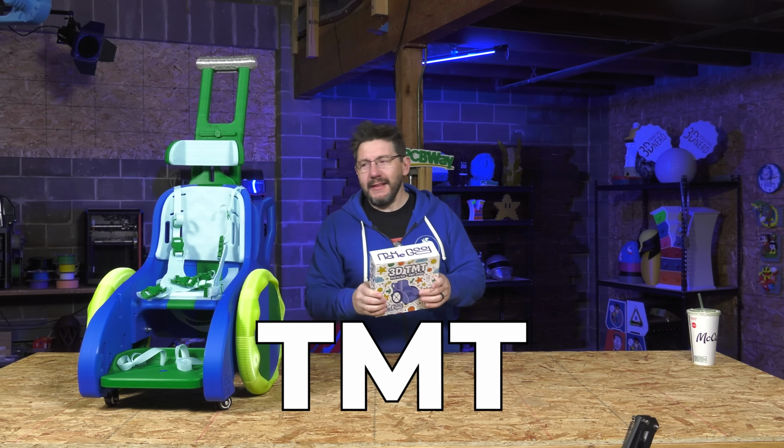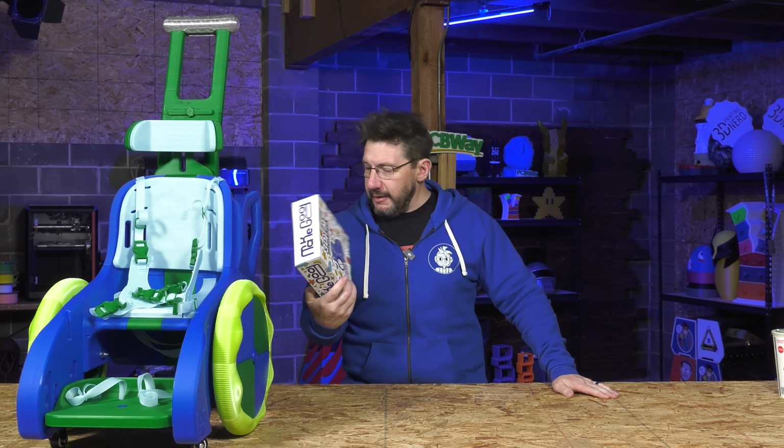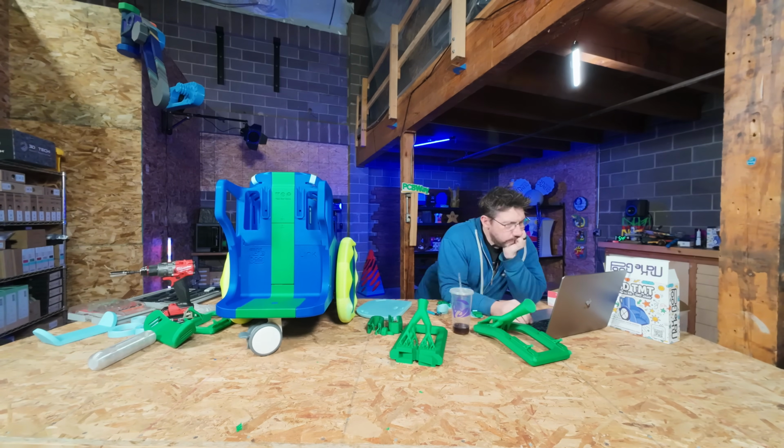This is the TMT, the 3D TMT, the toddler mobility trainer, and it's from MakeGood. You know those guys, they do really good stuff down in New Orleans, and I recently built one.